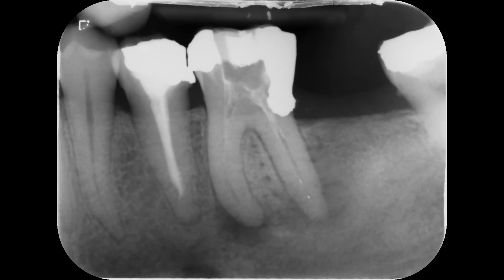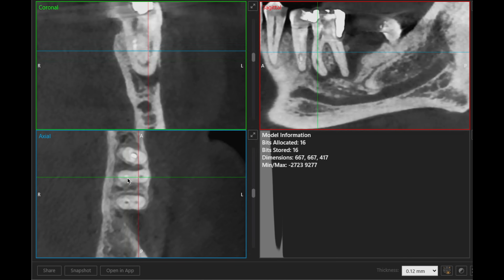Here you can see the pre-operative radiograph of the mandibular left first molar. The tooth is associated with a chronic abscess. It has a moderately curved mesial canal. The dentist had had trouble instrumenting to the full working length in the mesial canal and had created a ledge. Small volume CBCT clearly shows four canals in the axial view. We can also see the curvature of the mesial canal and the point at which the ledge has been created in the apical third.